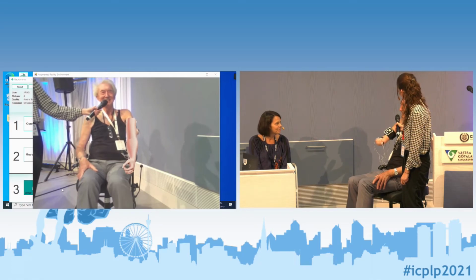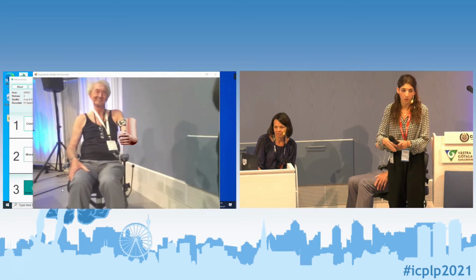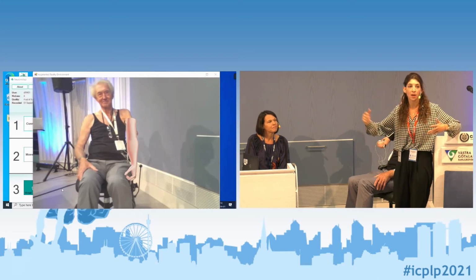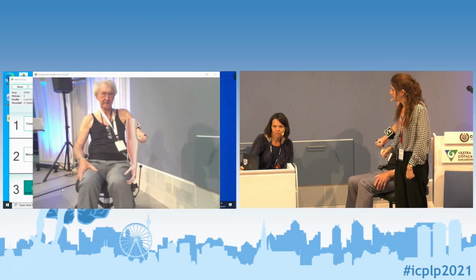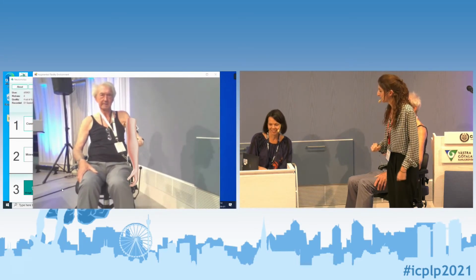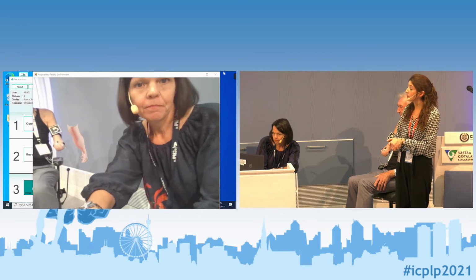Yeah, that's perfect, and that's important. If you try this system with your patients, it's very important that you have a nice space and area to actually be able to move and see all the range of motion. It doesn't follow, something is wrong. It's because we are online, so sometimes it happens. So yeah, this is another of the sections that we have in our treatment.